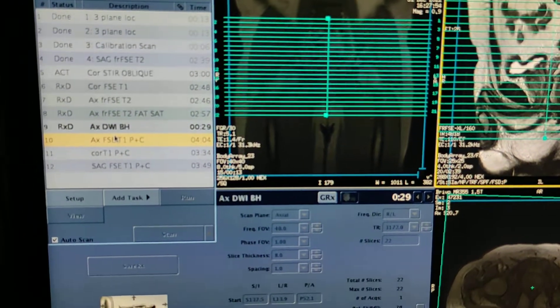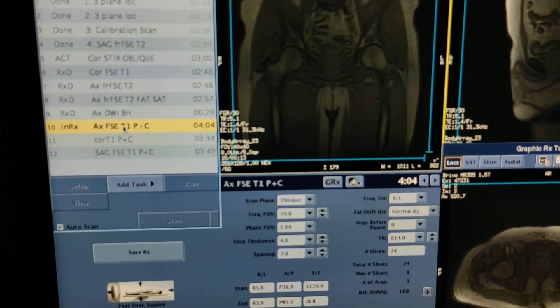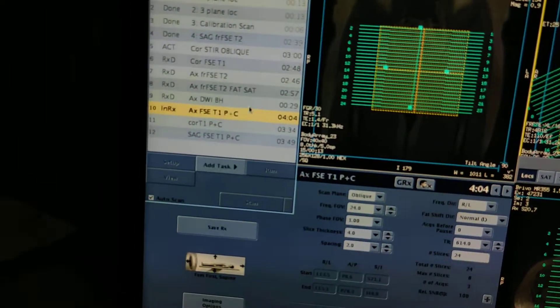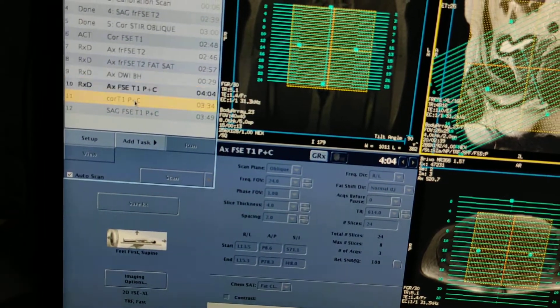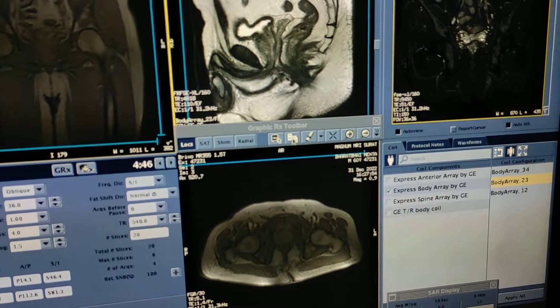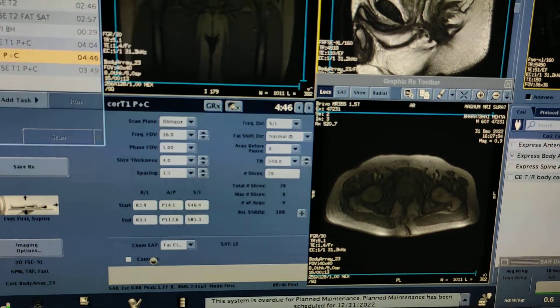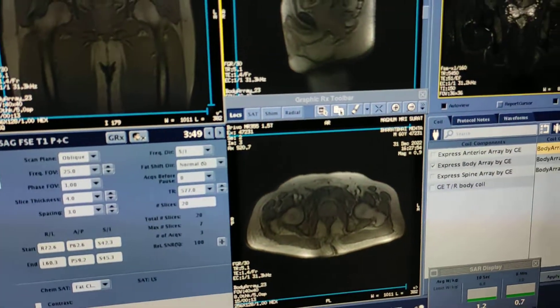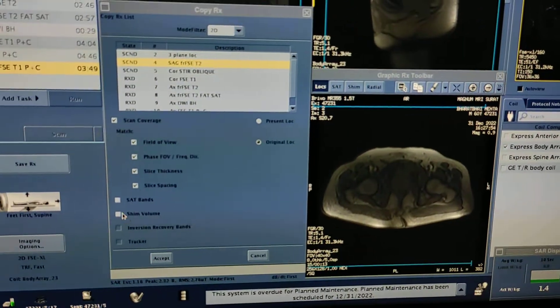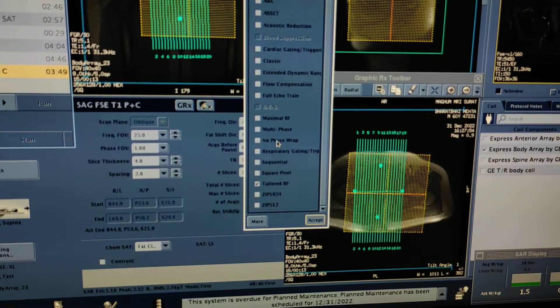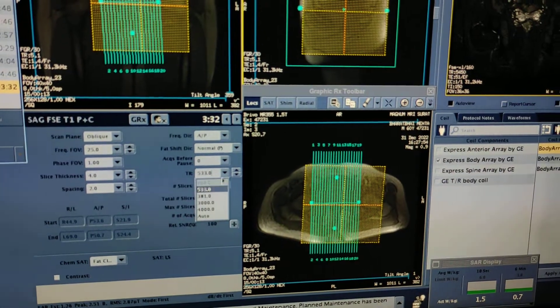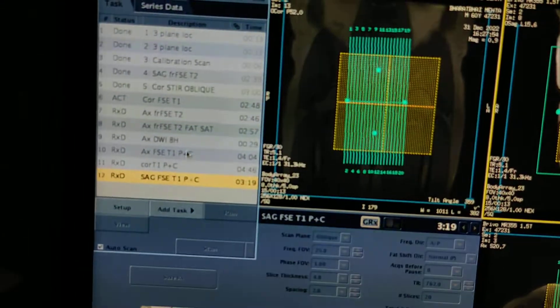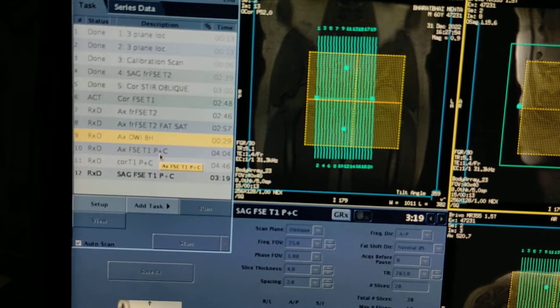Now wait until these sequences get scanned. For axial post contrast, copy with axial — this is the post contrast sequence, save. Back click open, copy with coronal — coronal also ready, save. Keep the machine on auto scan. Copy with sagittal. First scan all the routine sequences, then pause the machine after DWI and give IV contrast, then start these three post-contrast sequences.